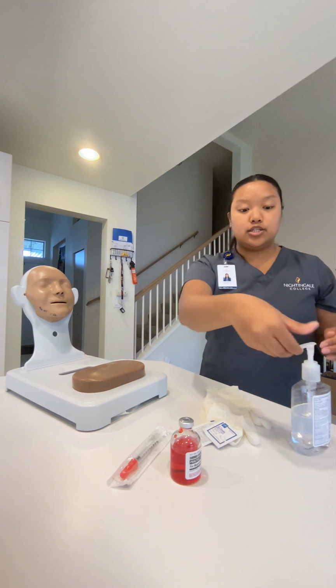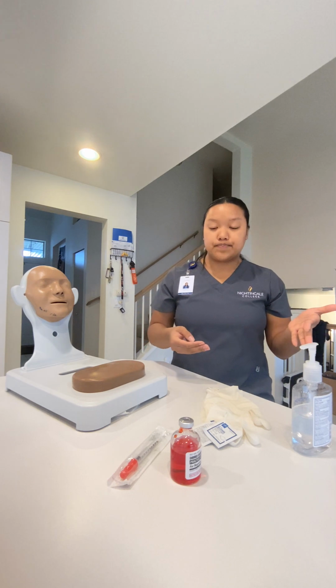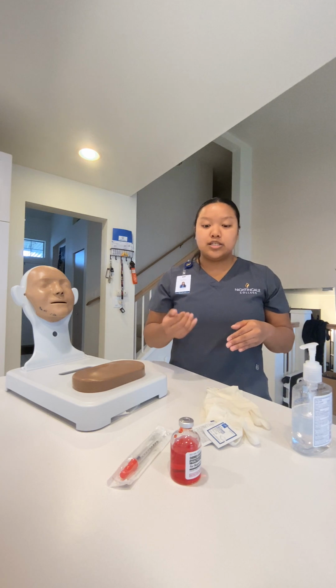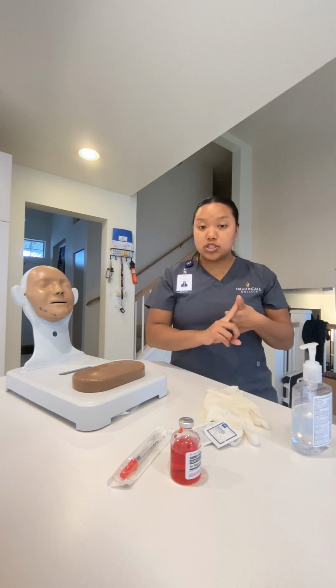Now I'm going to do my hand sanitizer. I'm going to go to the medication room and confirm the provider's orders. The provider ordered 1,000 units of heparin subcutaneously, 1 dose. So that is what we're going to give to our patient. I'm going to confirm the correct patient, Ms. Poma.